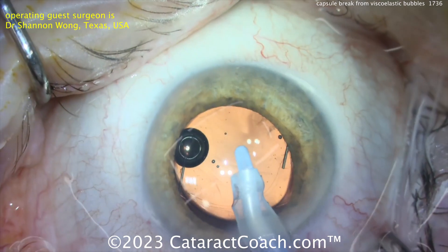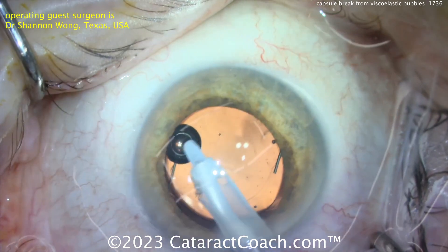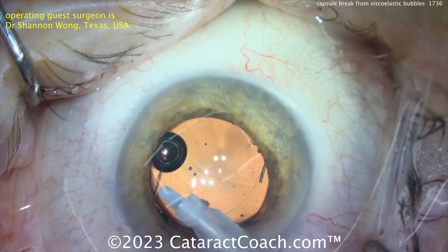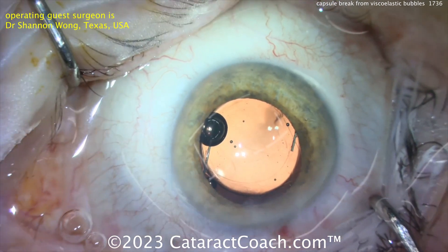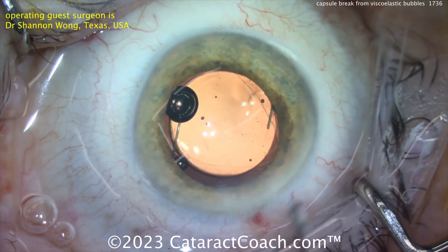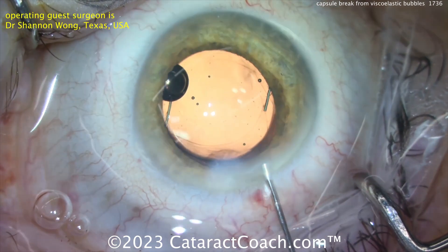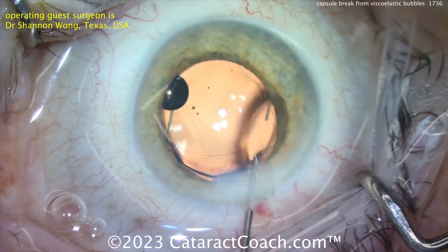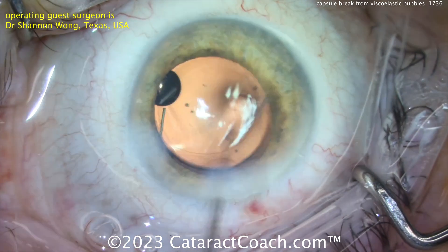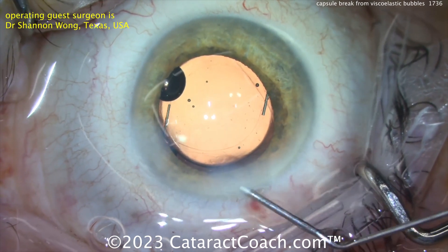The upside: the patient will never need a YAG laser capsulotomy. The first case shown involved a single-piece acrylic trifocal lens — a tougher situation because it was anterior to the rhexis, a reverse optic capture, with haptics behind the rhexis and the optic in front. In that scenario you have to lower the IOL power to account for more anterior positioning, though those patients can do well long-term with careful follow-up.